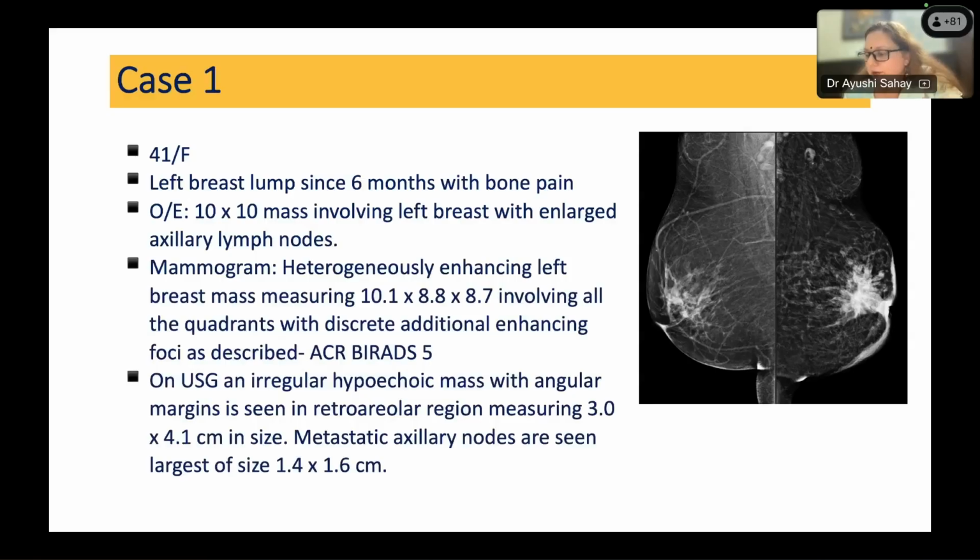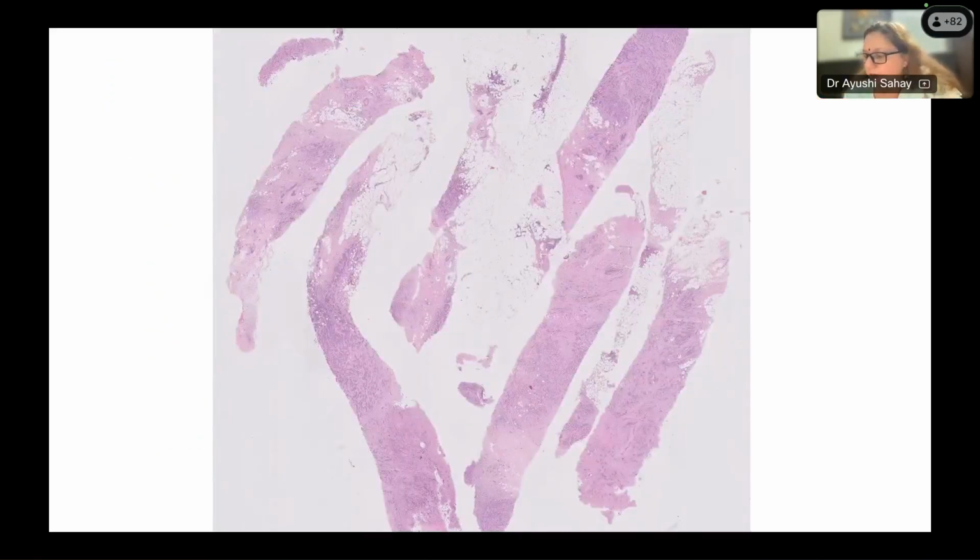So I think we can start with Pooja maybe. Pooja, would you like to describe the slides? Or any of the students who have thought they would like to take the first case can volunteer.